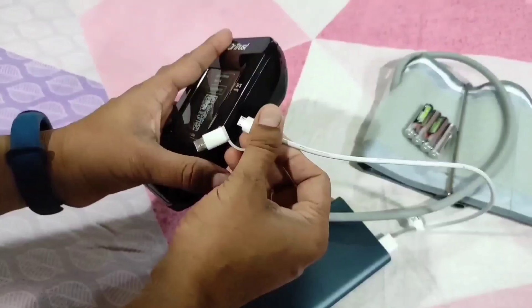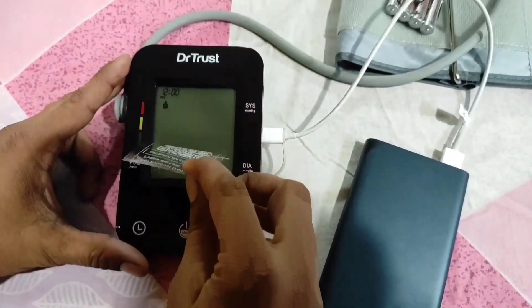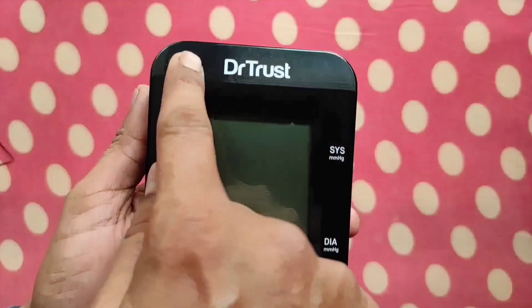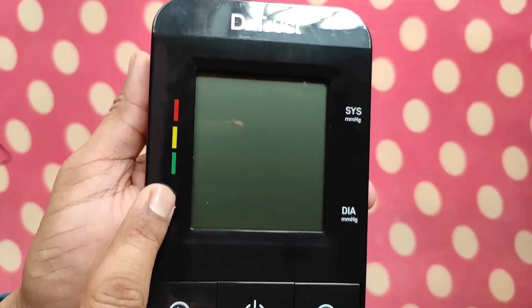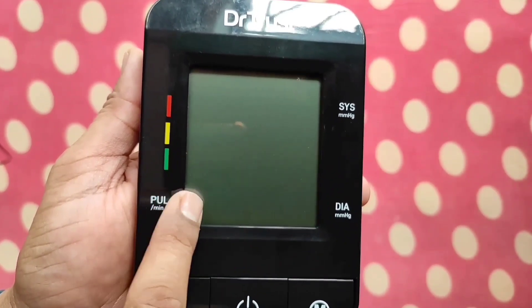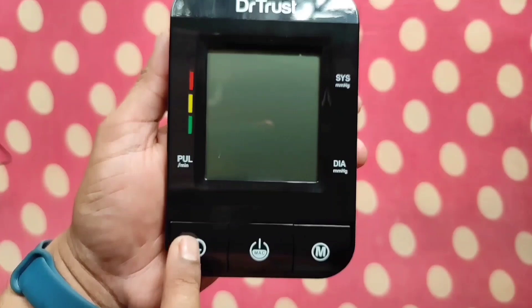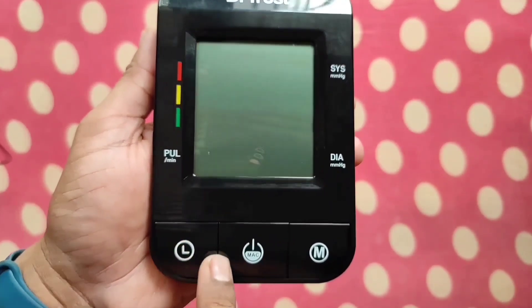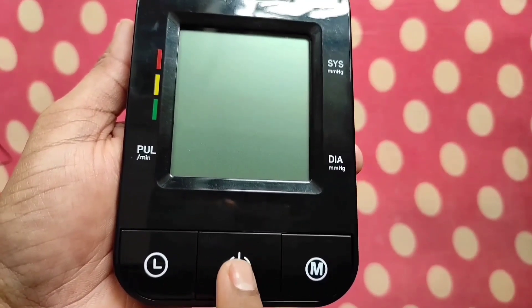This BP monitor can be operated in two modes: 4 AAA batteries and USB. On the monitor, you can see the Dr.Trust branding on top, the WHO indicator, pulse rate indicator, systolic pressure indicator, and diastolic pressure indicator. This is the time button to select time and date, and this is the power button for measurement in standard mode and MAC mode.